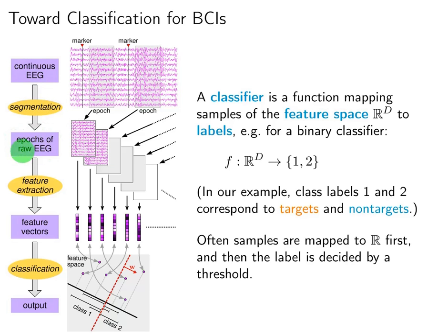We will get, as a result, epochs of raw EEG, and then from raw EEG we need to extract features, usable features, okay, that can be used in the classification. So graphically, from continuous EEG with the time markers, where the marker 1 corresponds to standard or deviant stimuli onset, we construct these kinds of features or segments of EEG.